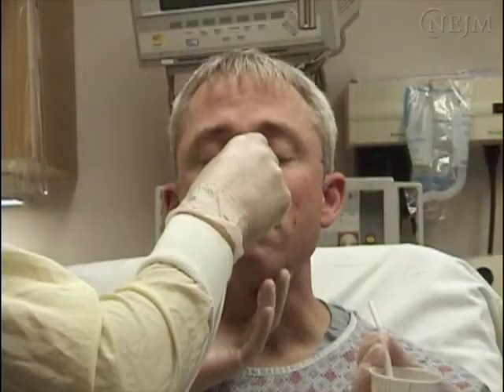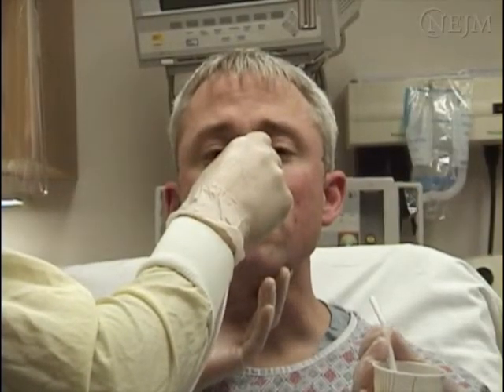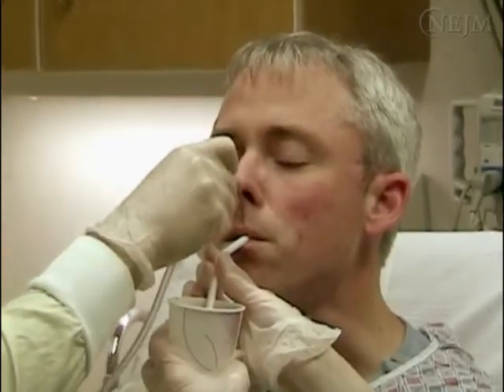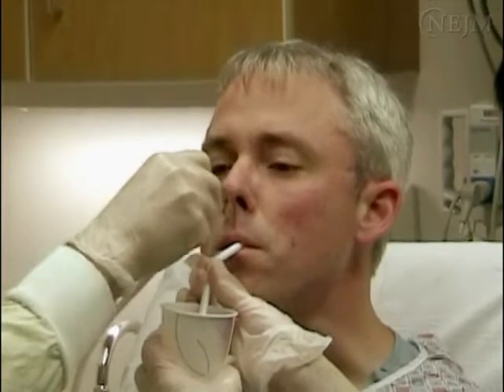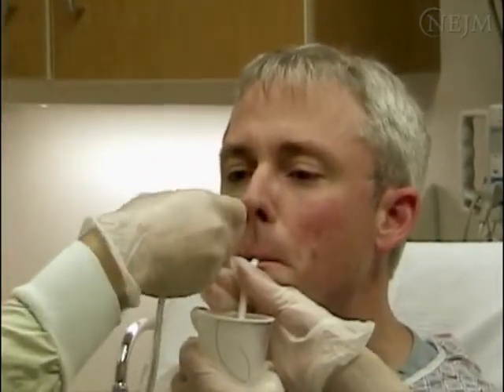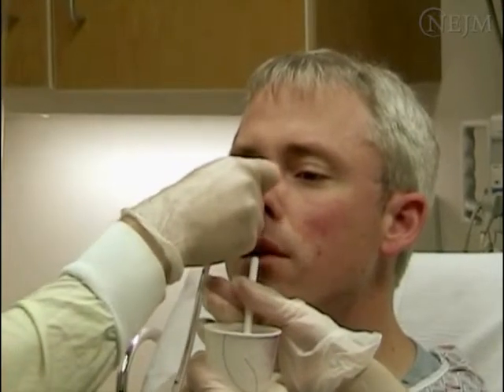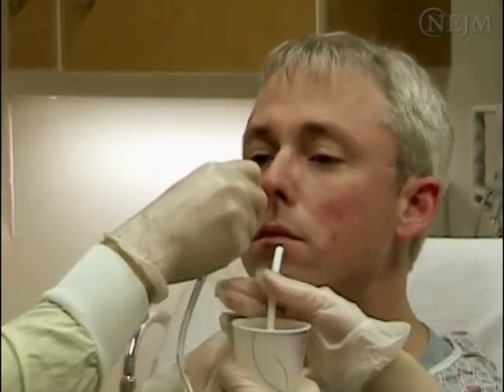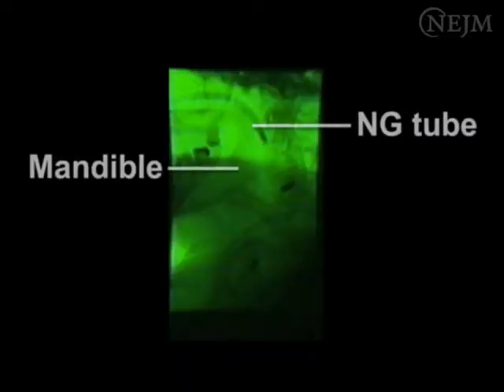The patient may gag once the tube reaches the larynx. Temporarily halt the advancement of the tube and ask the patient to begin swallowing sips of water through a straw. Coordinating advancement of the tube with the swallowing mechanism facilitates passage of the NG tube into the esophagus and prevents entry into the trachea.